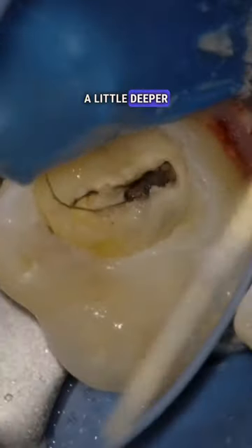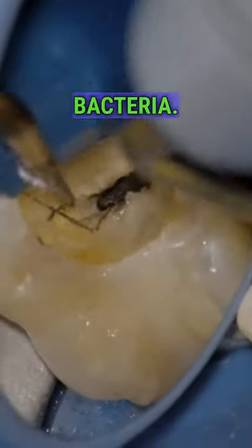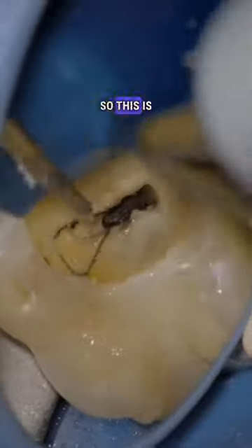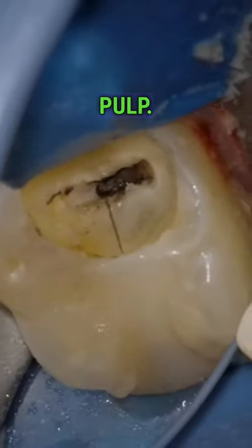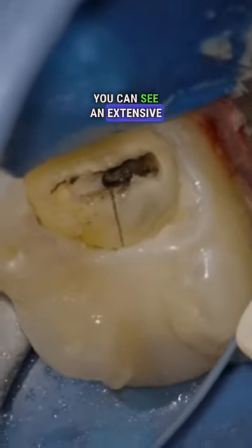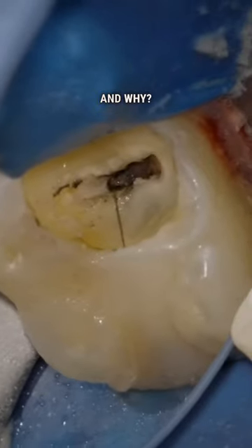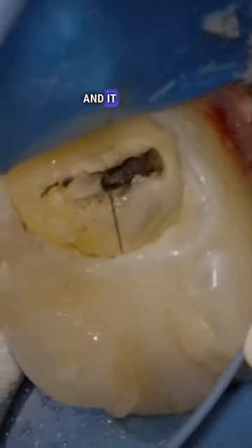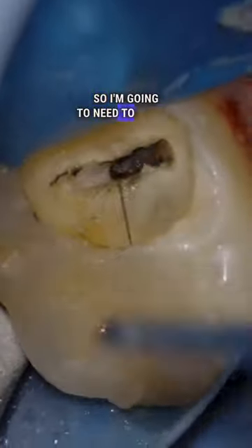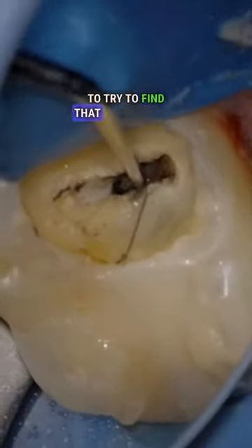As we get a little deeper, we start to see this black pigmented bacteria — this is anaerobic bacteria. Look at that residue of the pulp. You can see an extensive infection, very mature. And why? Because it was open to the oral cavity and it had that extensive decay. So I'm going to need to utilize these ultrasonics to try to find that mesial buccal canal.